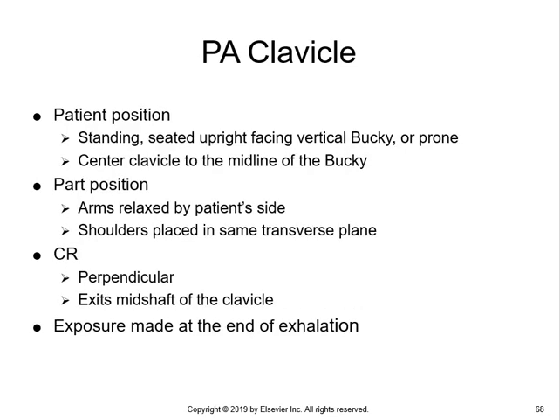The PA clavicle puts the clavicle closer to the image receptor, so you're not going to have quite as much magnification. In all honesty, I've never seen anybody shoot a PA clavicle. I'm not real sure why. It may just be because the axial is almost always going to be AP. And it just might make more sense to people to shoot AP and then AP axial rather than PA and then follow that up with a PA axial.